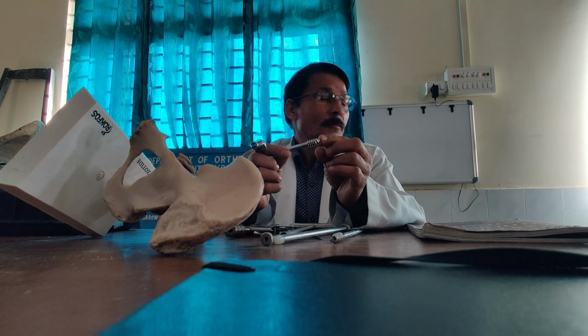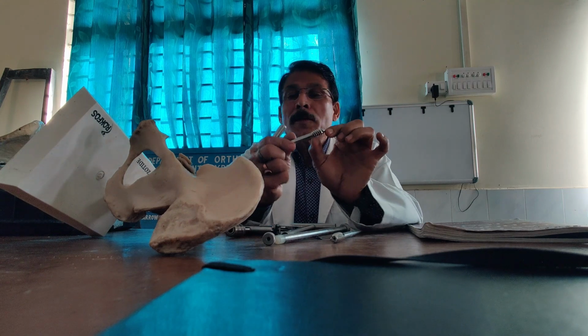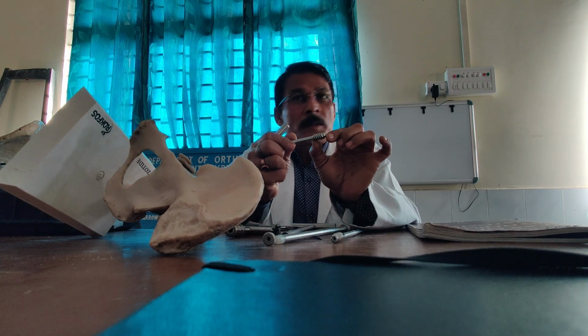Now let us talk about the components. What are the things? This is the lag screw, this is the plate. Again you have this one screw. I already discussed certain points about this. What is the length of this? What is the diameter? 12.5. What is the length? 22. Okay, sir?